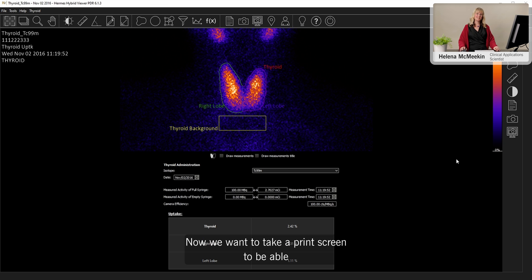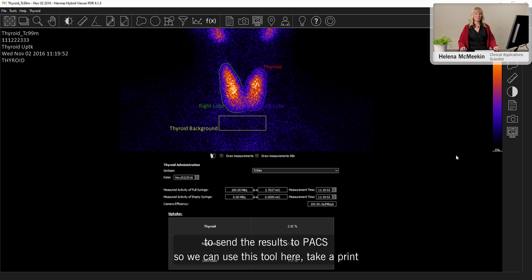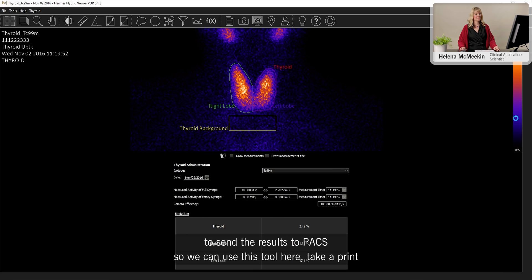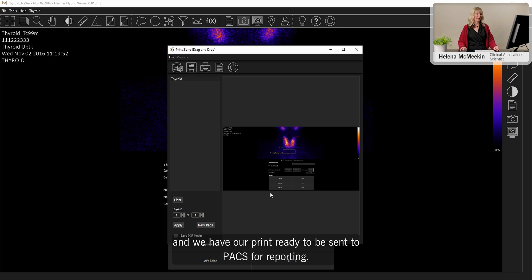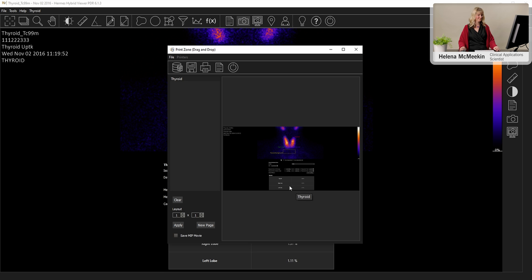Now we want to take a print screen to be able to send the results to PACS. So we can use this tool here, take a print. And we have our print ready to be sent to PACS for reporting.